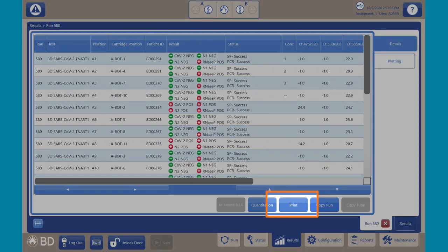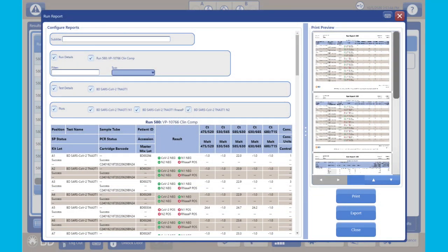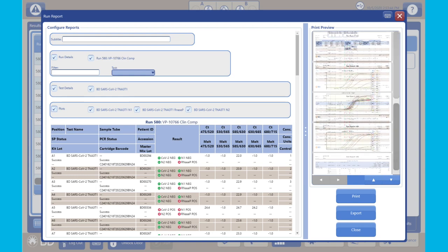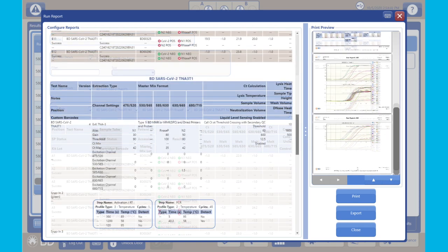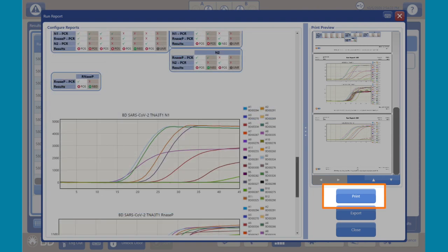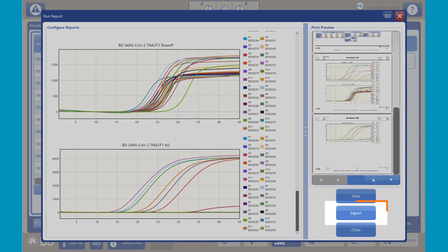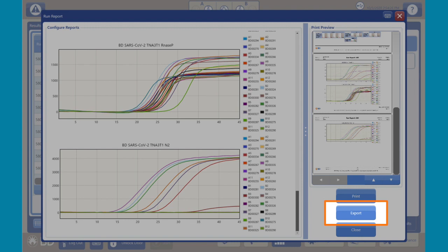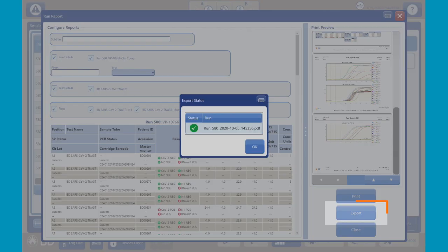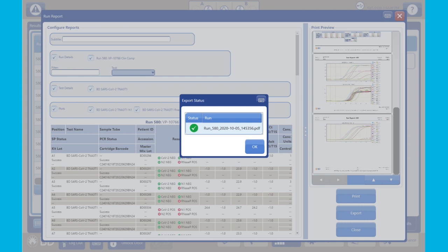To print the results, click the print button. The print preview window of the run report appears. The run report contains a table of detailed results and PCR graphs. To print the report to the default printer, click the print button in the print window. To export the report to a USB thumb drive, click the export button. The export operation exports results to a PDF file of the current run report.